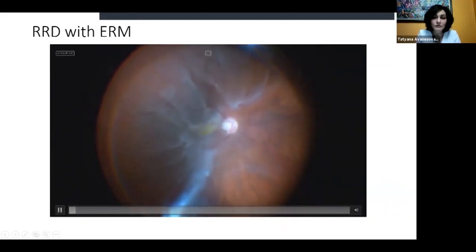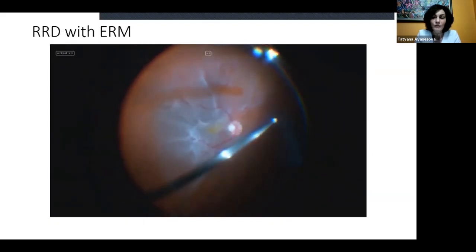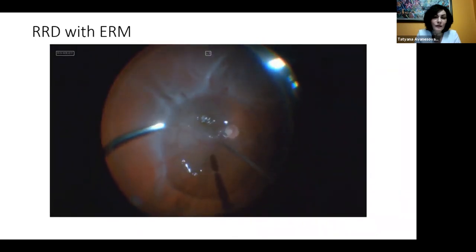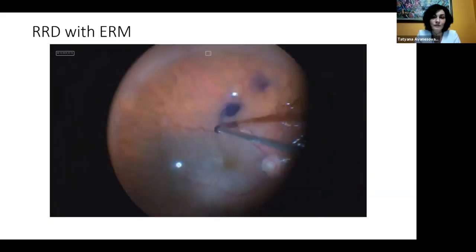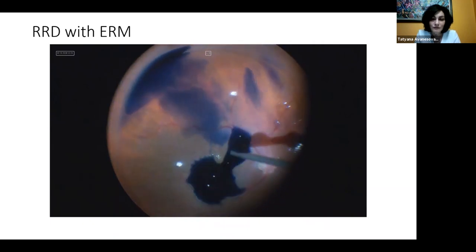This patient had retinal detachment for more than 1 month. And after vitrectomy, we put the PFCL and continue on the periphery with scleral depression, with shaving the base and periphery. And I prefer to stain under the PFCL.